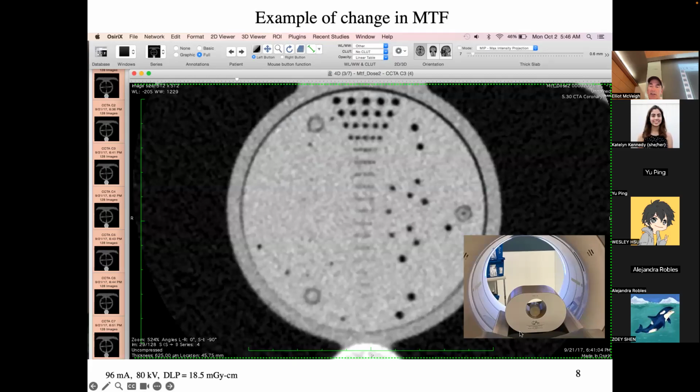There's basically an X-ray source here and a detector over here. And this is a simulated human torso, you know, how many X-rays get absorbed. And then in there we have a phantom, and you make phantoms into geometric shapes so that you image them and you know the underlying geometric shape. And ask the question, like, what comes out of the scanner? Is it exactly the same as the phantom? And I know exactly what that shape is.